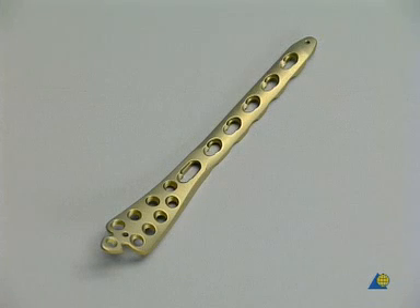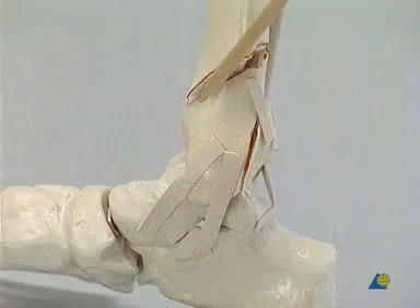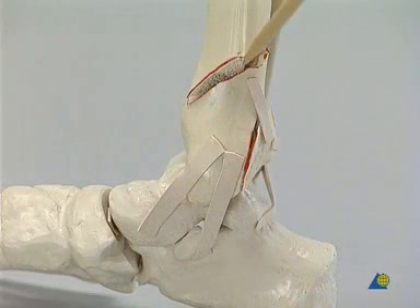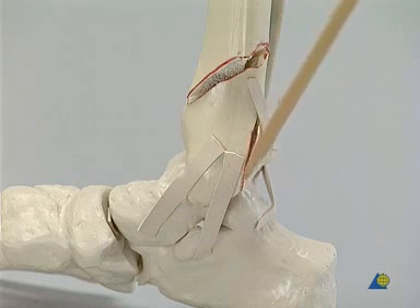It's based on the internal fixator principle. This plate is pre-contoured anatomically to the bone. On the plastic model, the level of the undisplaced fibula fracture is indicated, and the plane of the short oblique distal tibia fracture can be followed. A small posterior lip or Folkman's triangle has been avulsed, but because of its size, it will not be fixed separately.